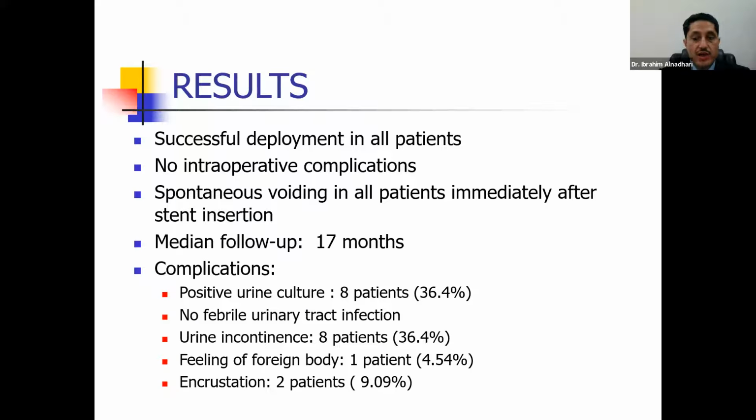So successful deployment was carried out in all patients. We didn't have any intraoperative complications, and spontaneous voiding happened in all patients after the insertion, with a median follow-up for our patients of 17 months. As for complications, 8 patients had positive urine culture, but we didn't have any patient with febrile UTI.